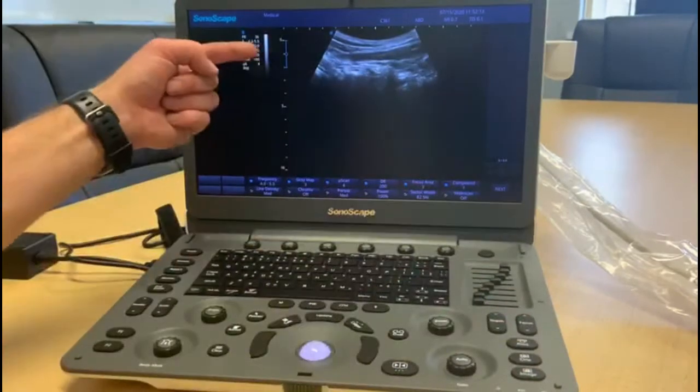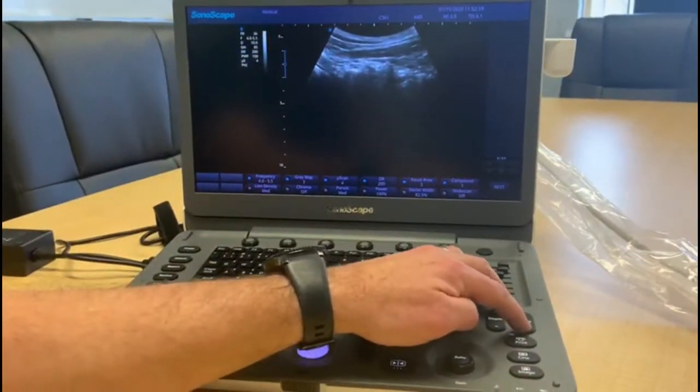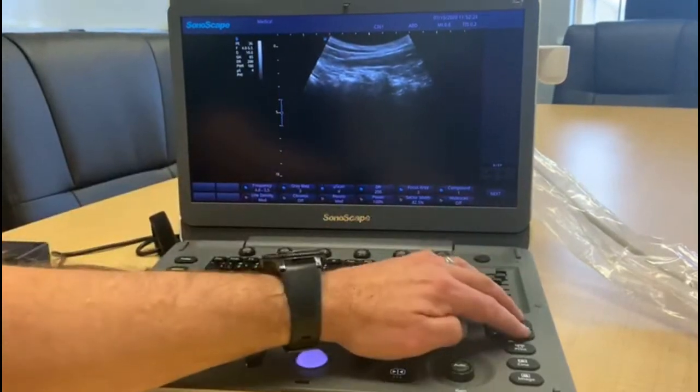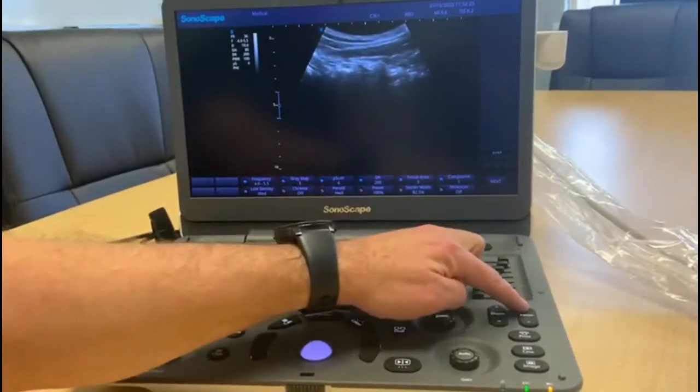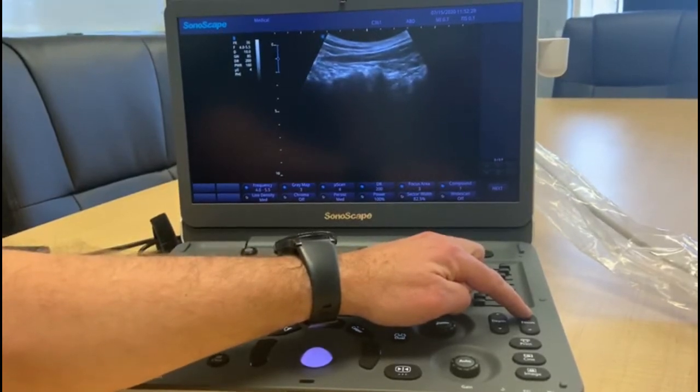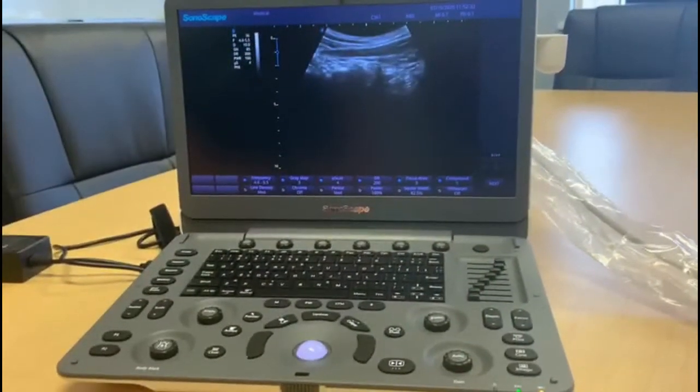The focus point allows us to change where the machine is actually going to focus the main beam. You can see it dropping down, and here we start getting into the zone of where we're imaging, which is useful if that's what we want to image.